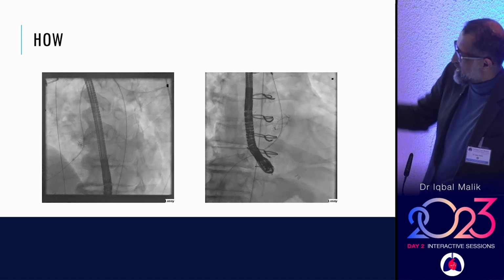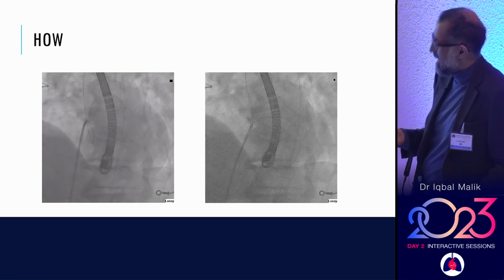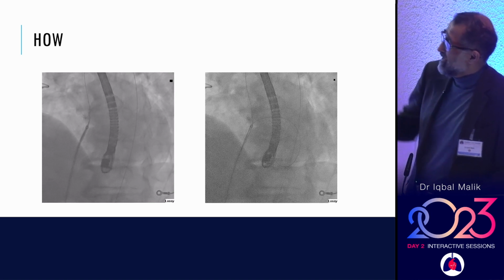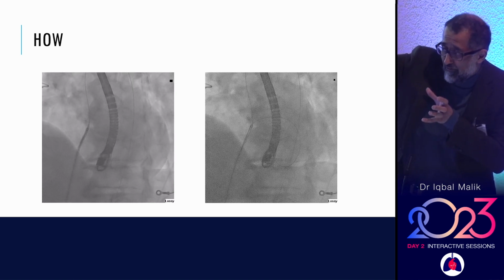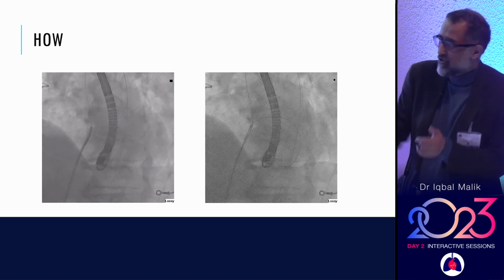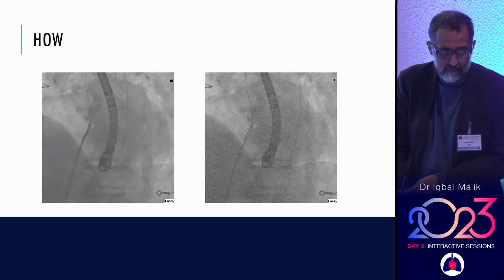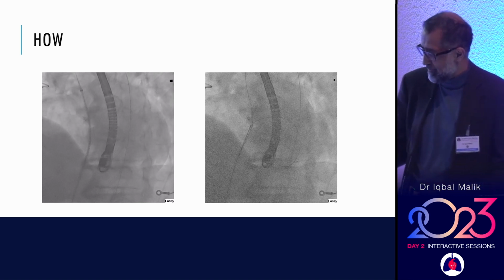But create a rail. So we'll carry on. We've created a rail. Okay, I've got my catheter through. But actually, if I leave my wire going all the way up into the aorta, my first bit of device is going to come into the aorta, probably above the aortic valve because there's no space below it. So I then got another wire into the LV so that I can then have my catheter swinging into the LV so I can safely put the plug out.